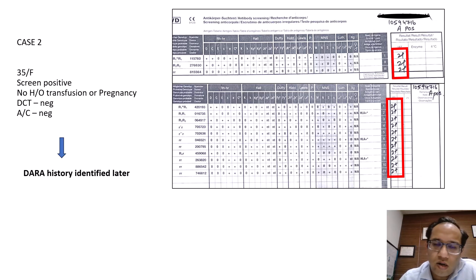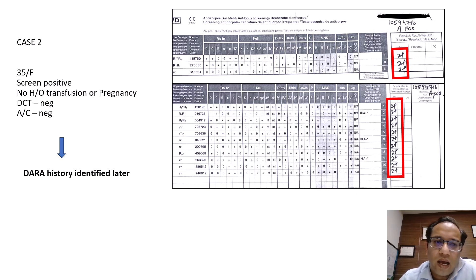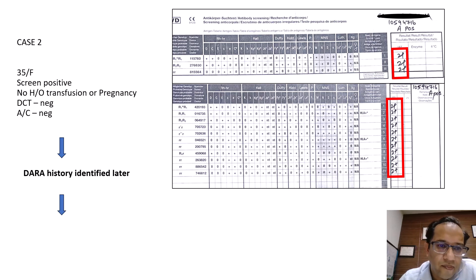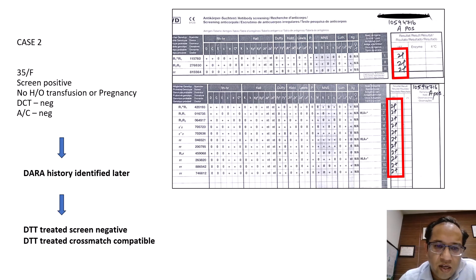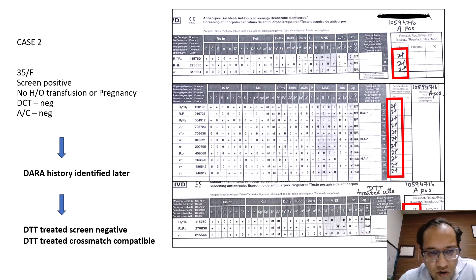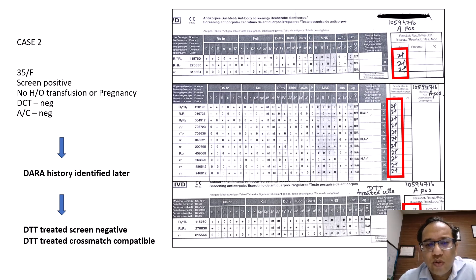We went ahead and took the history, and found that the patient was a case of multiple myeloma who had been given daratumumab. Once that was known, we performed DTT-treated screening, which came negative. DTT-treated cells were used as donor cells, the crossmatch came compatible, and we were able to issue the blood.